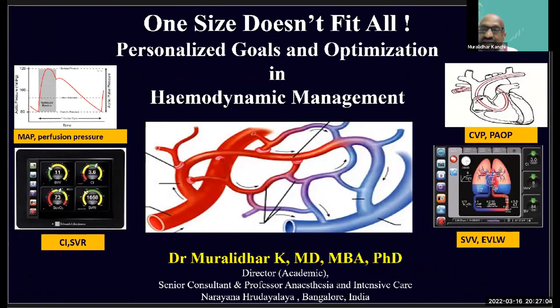To begin with, I would like to say that achieving hemodynamic stability, where both macro and micro circulation is doing well during high-risk surgery and in critically ill patients, is a formidable challenge. In fact, we have several parameters, both invasive and non-invasive, that guide us to administer fluids, vasopressors, inotropes, etc. And we have a concept of goal-directed therapy, which utilizes these monitors to assess the cardiovascular system and guides us to intervene as necessary.